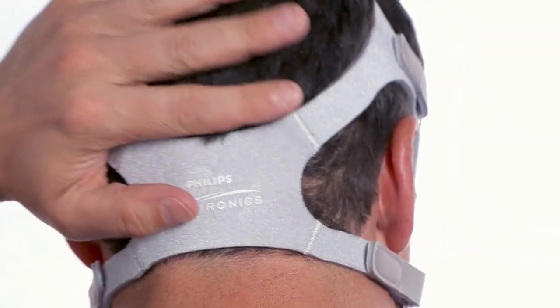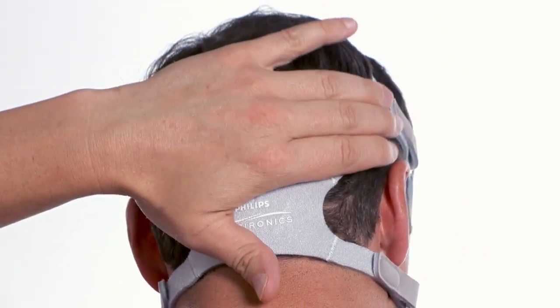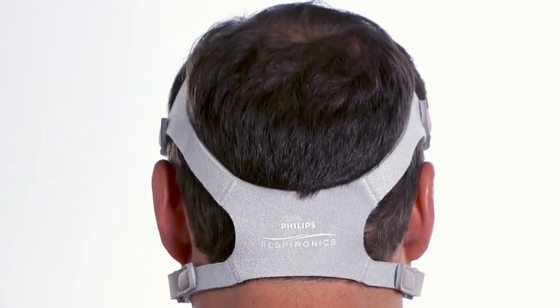If needed, you can make adjustments while sitting up. Adjust the bottom straps evenly. The mask should rest lightly on your nose. Check the headgear to make sure that the straps are parallel and flat across the back of the head.